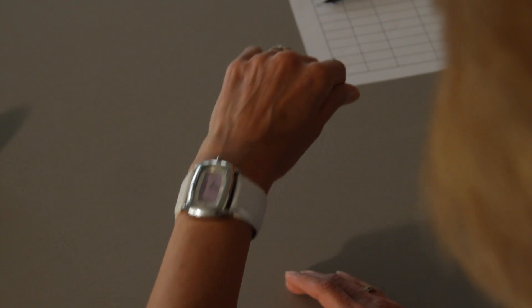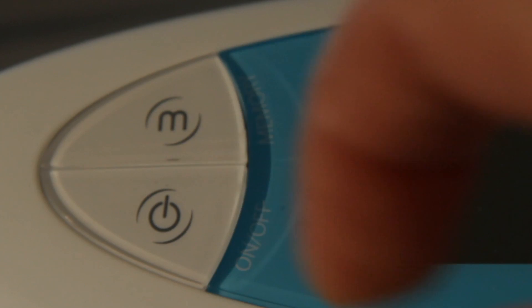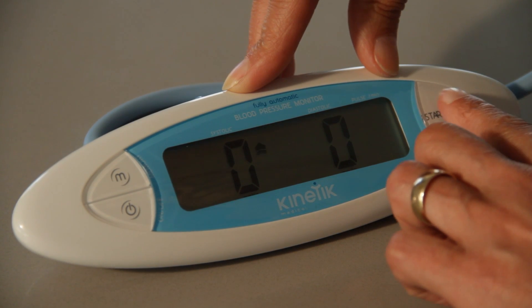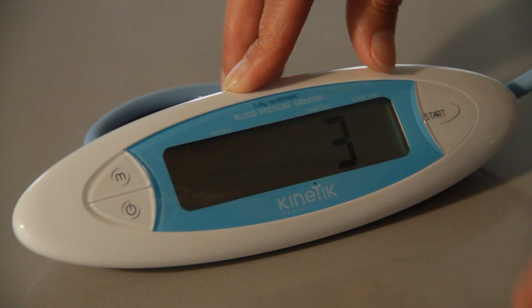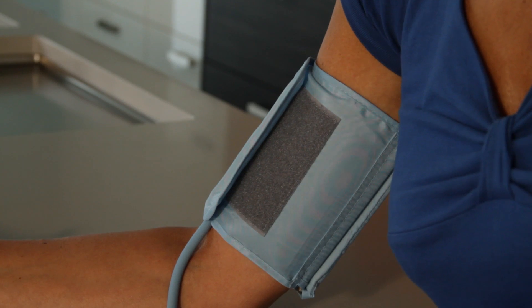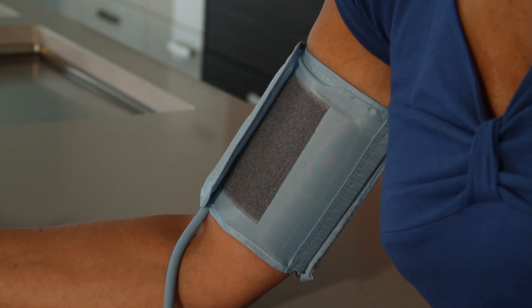Rest in the seated position for five minutes after you have fitted the cuff. When you are ready and comfortable, press the on-off button followed by the start button. The Kinetic Blood Pressure Monitor will automatically inflate and measure the blood pressure reading. Take two or three measurements on each occasion, staying as still as possible between each reading.